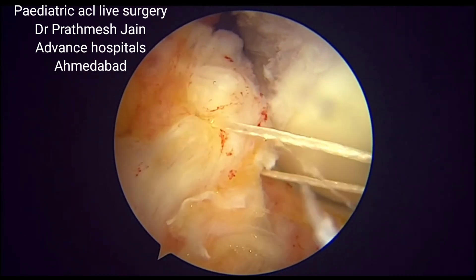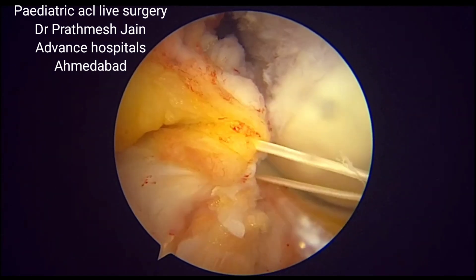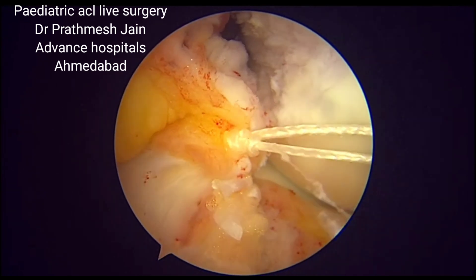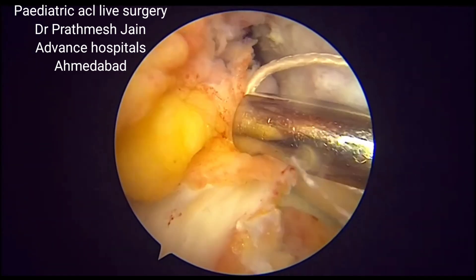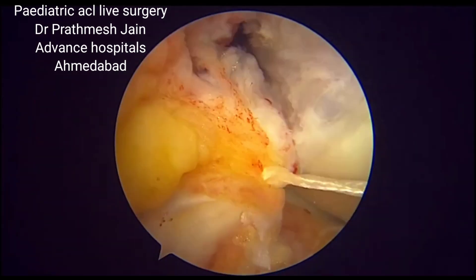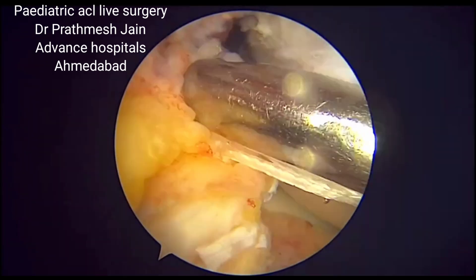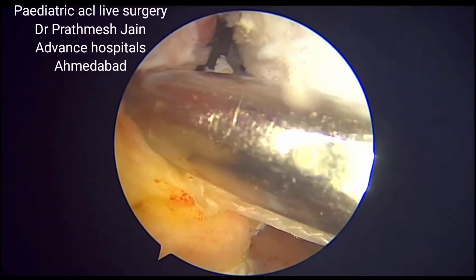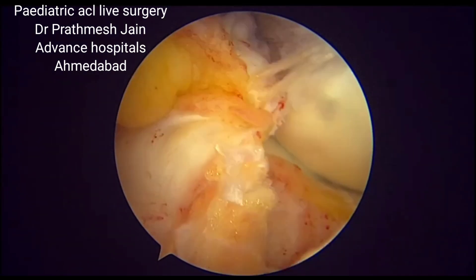Another very important aspect of this graft is that it also acts as a Lemaire procedure. By rerouting it and bringing it anteriorly from the posterior aspect, you are effectively creating a lateral extraarticular tenodesis as well, giving very good stability on the extraarticular aspect.